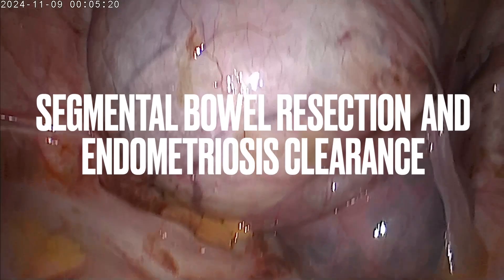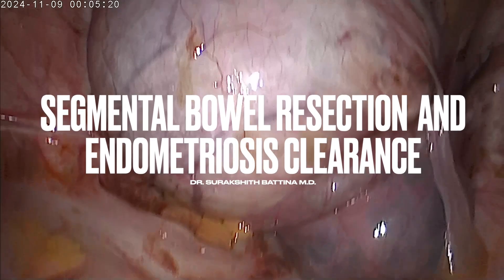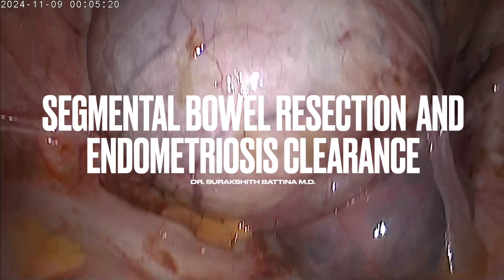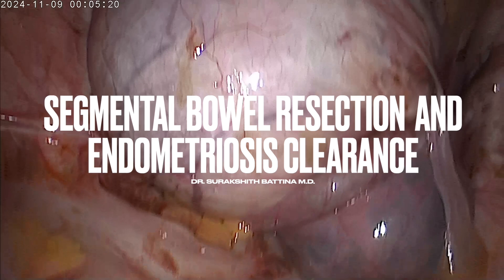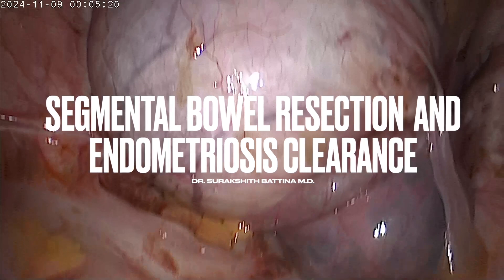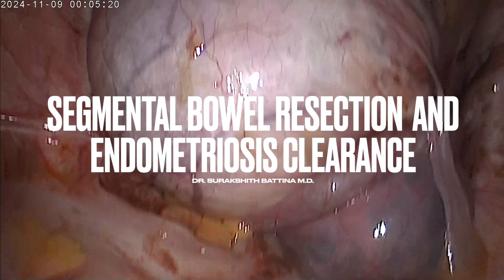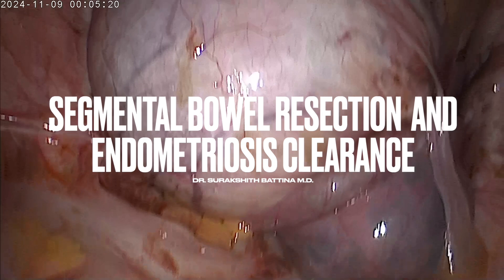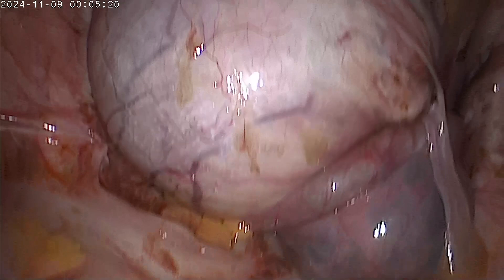Hi, my name is Dr. Surakshit Bhatina. I am an endoscopic gynec surgeon and today I will be explaining to you the steps of a segmental bowel resection with endometriotic clearance for a 28-year-old woman who is suffering from excessive pain and bowel issues during her period.